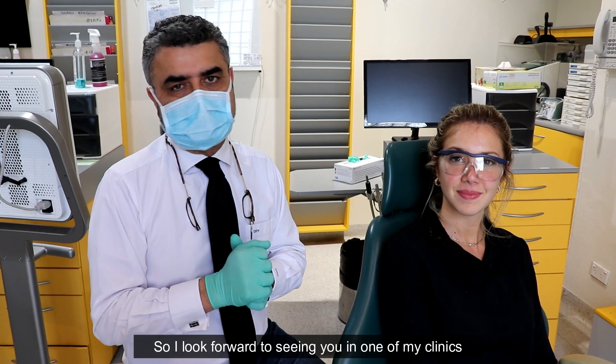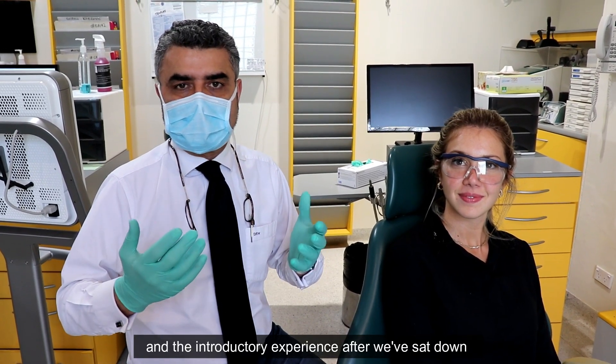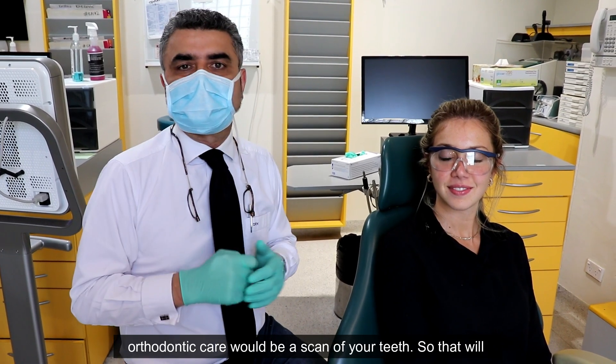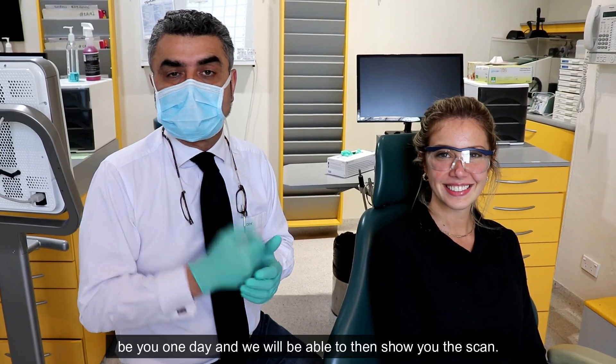I look forward to seeing you in one of my clinics. The introductory experience, after we've sat down and talked about what options you may need for your orthodontic care, would be a scan of the teeth. So that will be you one day, and we'll be able to then show you the scan.